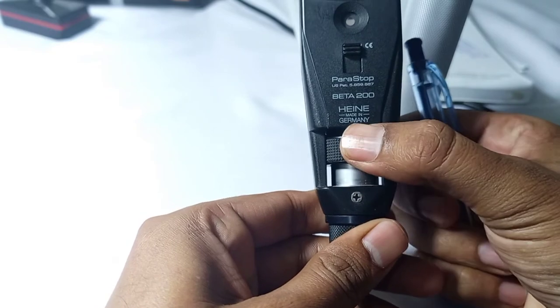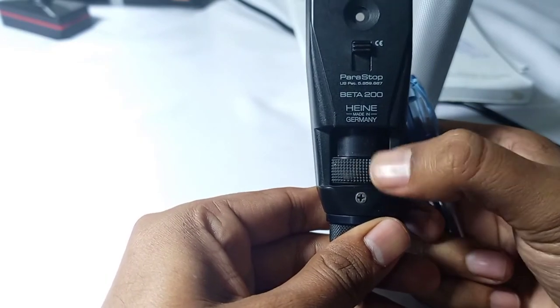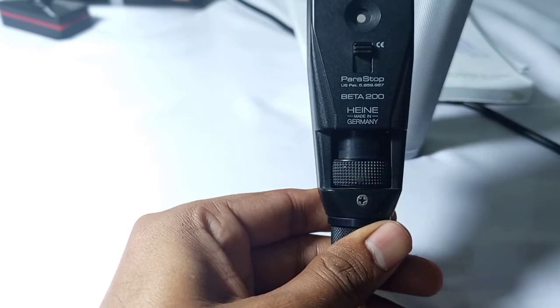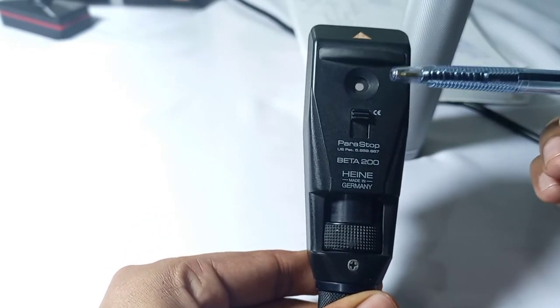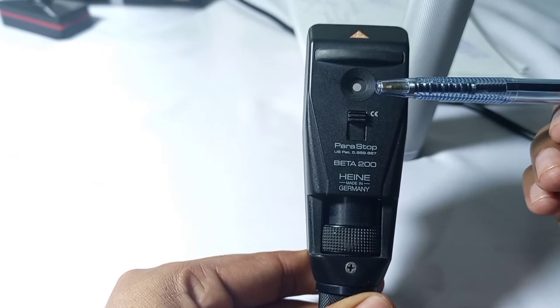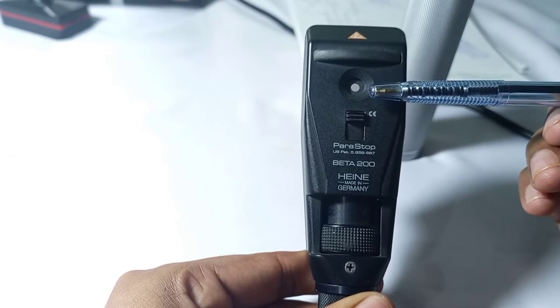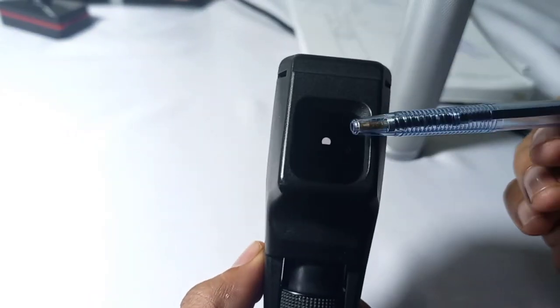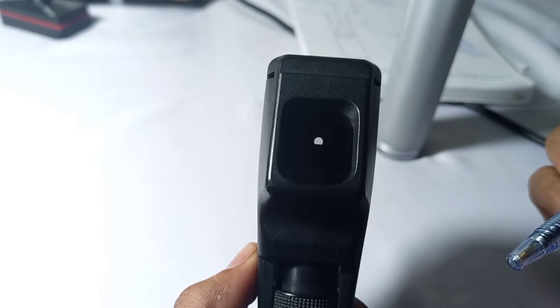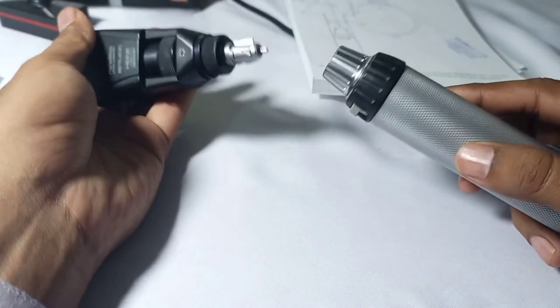This sleeve can move up and down and can also rotate. This is called the peep hole of the retinoscope, from where the observer will see the reflex in the patient's pupil. This side of the retinoscope will face the patient.